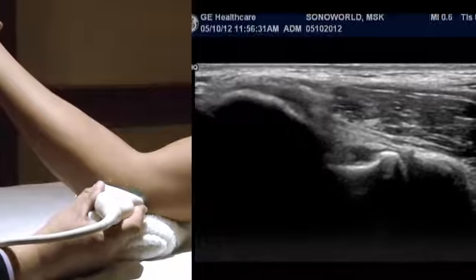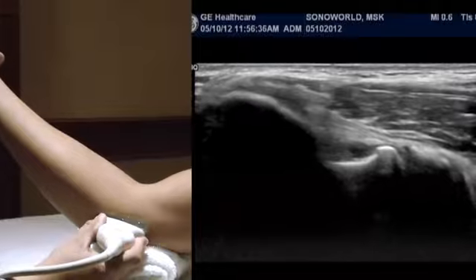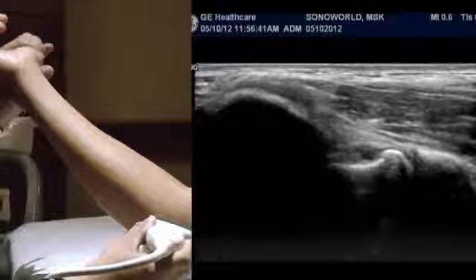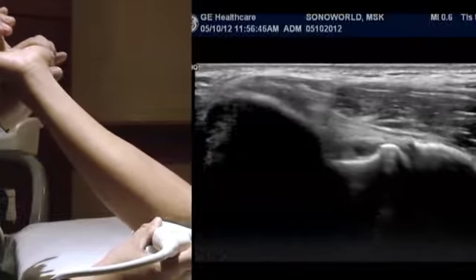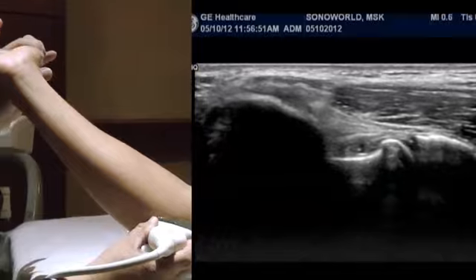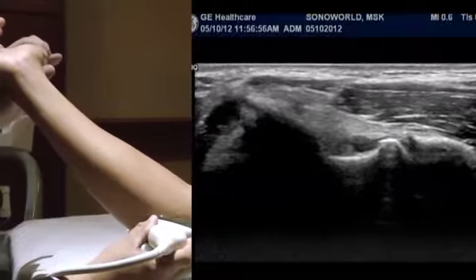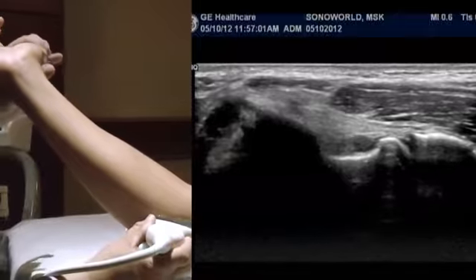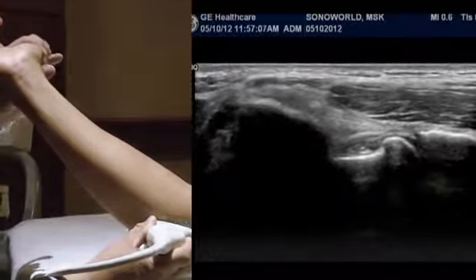You're going to passively show what's going on by grabbing the thumb of the patient and do the Laura Timmerman type of maneuver, wherein now you could do a valgus stress and you stretch the ligament and also try to see if you can open up the ulnotrochlear joint. Those are the two criteria: a disruption of the packed fibrillar pattern of the ulnar collateral ligament and a widening of the joint space of the ulnotrochlear region.